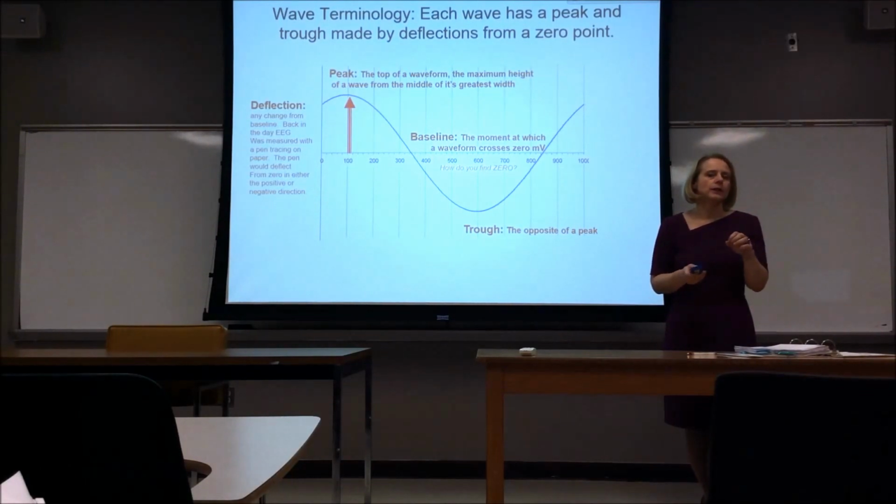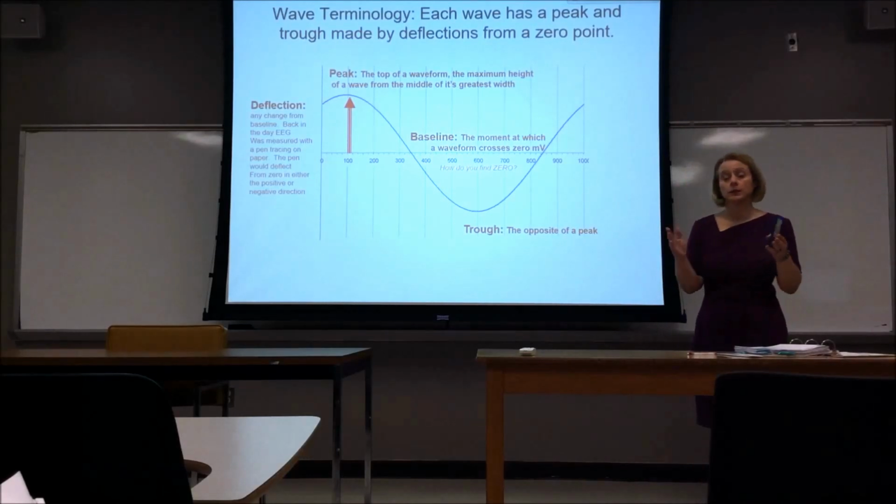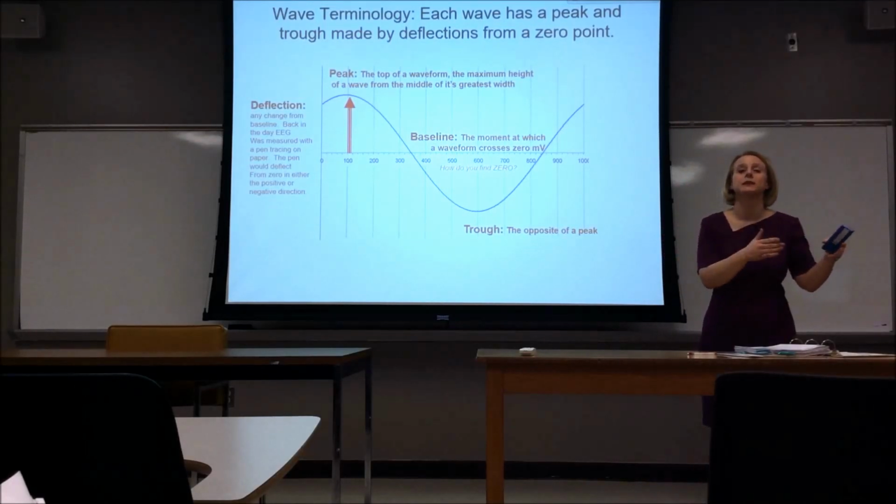And standard EEG in an adult ranges from 0 to maybe sometimes 20 microvolts. And an eye blink is 70 microvolts, to give you an idea of the change in the size. I often measure signals from 1 to 2 microvolts, but 7 is a real standard, what we expect to see in an ongoing EEG. And so we're talking itsy bitsy. That's what a microvolt is.